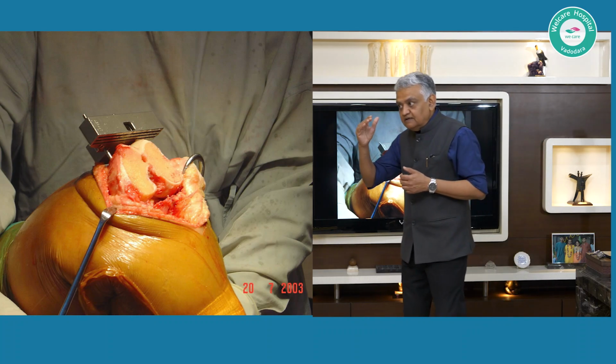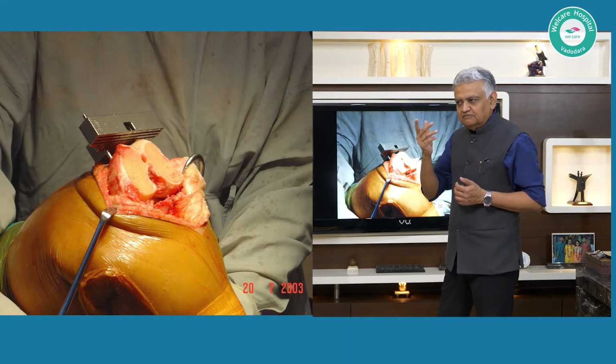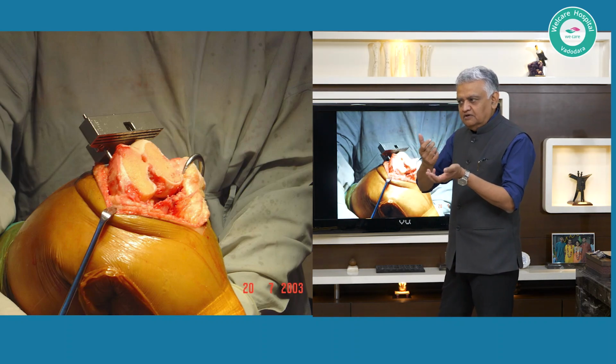As a conscious effort, try to see whether you are able to control that. In other words, your finger is controlling the trigger with that finesse.